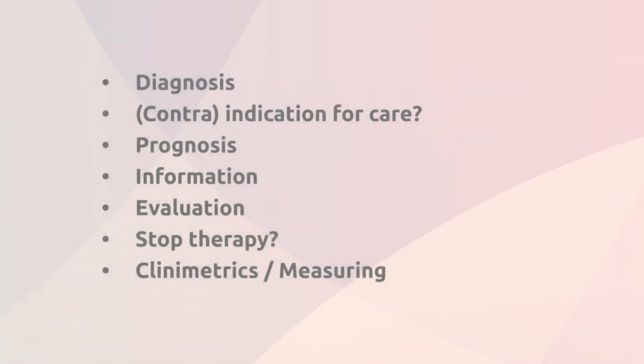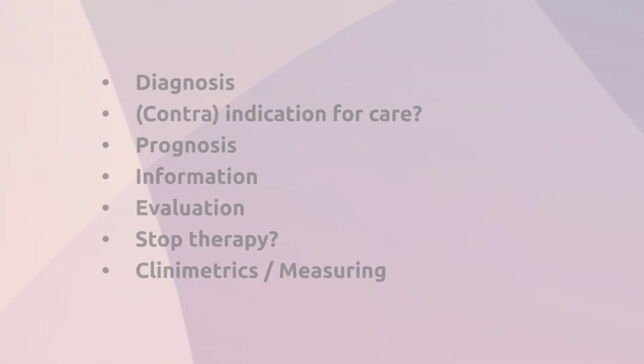MSU is not only suitable for diagnostics, but also for lots of other reasons. I will explain a few of these as an example by using pathology images. I can show you hundreds of different anatomical structures and even more pathologies, but let's keep it clear and simple. Let's focus, as an example, only at several normal, everyday pathologies of the supraspinatus tendon.